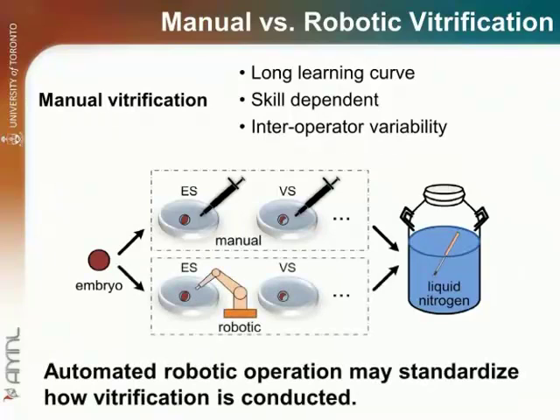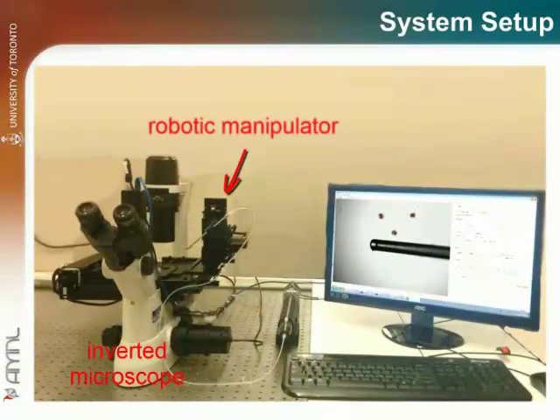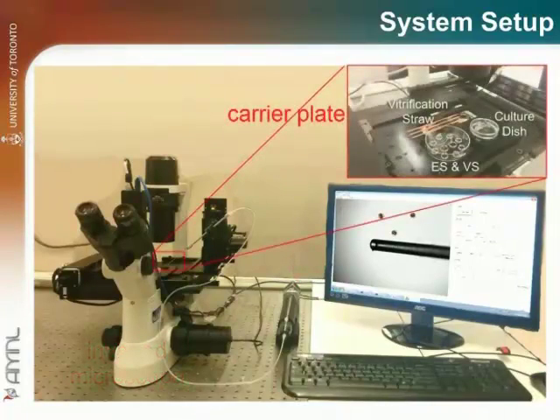We have developed a robotic vitrification system for automatically processing embryos and oocytes. The robotic system is built around an inverted microscope. A robotic manipulator and a motorized syringe are used to automatically pick and place embryos or oocytes. A custom-designed carrier plate is placed on the XY stage to hold an embryo culture dish, a multi-well plate, and multiple vitrification straws.